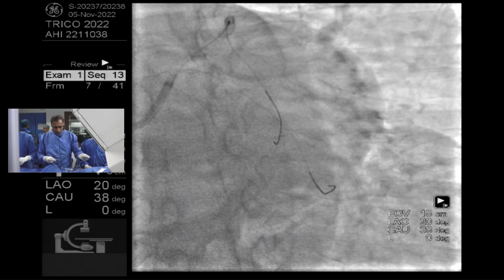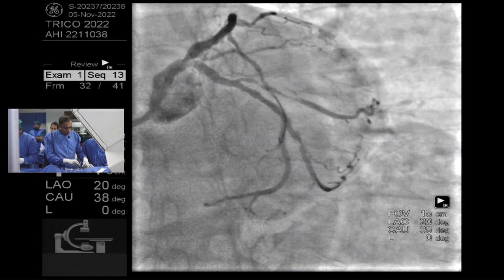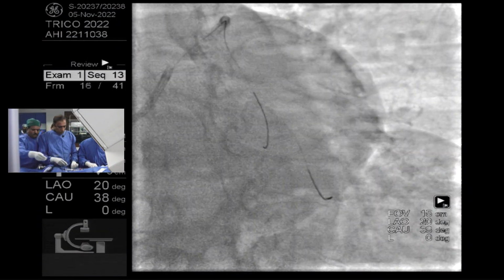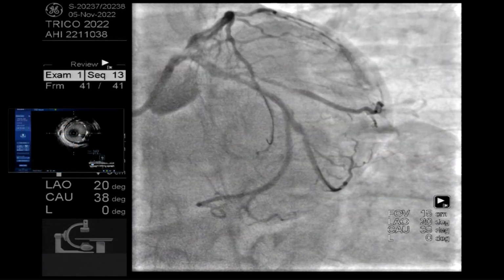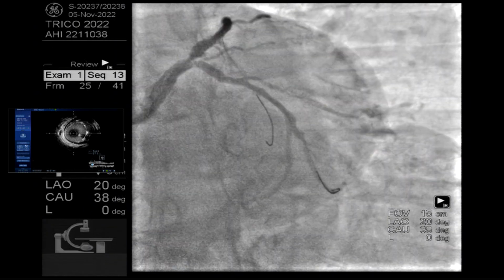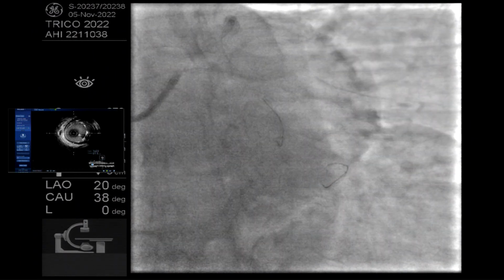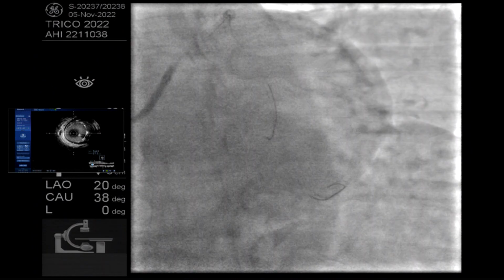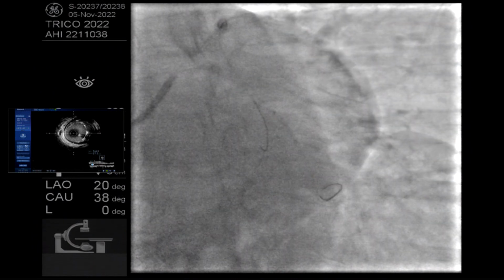And you routinely do kissing for the provisional approach of the left main? Yeah. And meanwhile you're working, can we review the IVUS again? Because angiographically it's not impossible to think also of just stenting the ostial LAD and spare the bifurcation, but maybe IVUS will tell us a different story. We'll try and figure that out here.